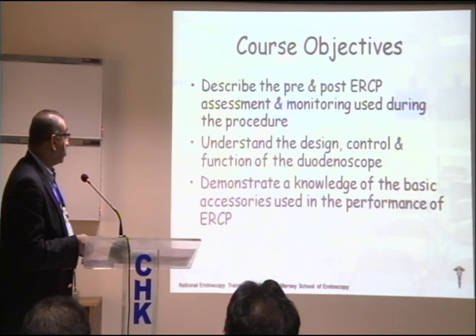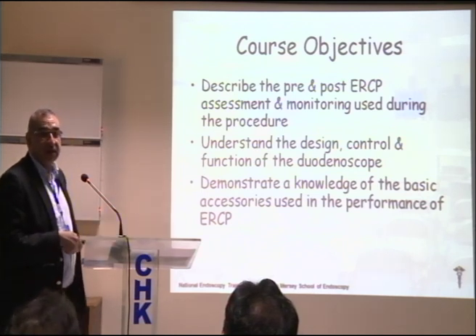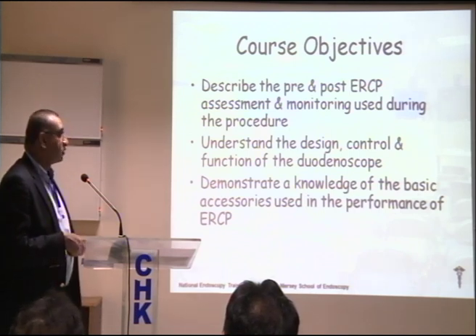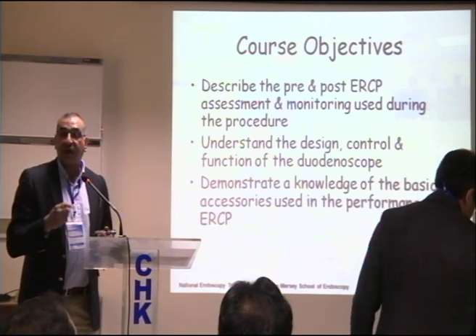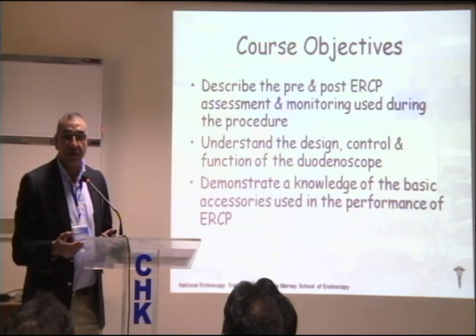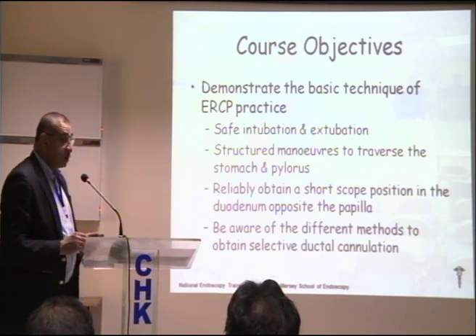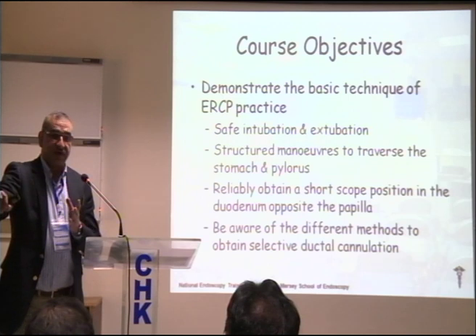Understand the design, control, and function of the duodenoscope, because we'll go through with the models and with the scopes, and demonstration of the basic accessories used in the performance of ERCP. All the cannulas, the guide wires, the sphincterotomes, the stents that you use, we'll try to make you familiar with those, right? The most important aspect of this course is communication.